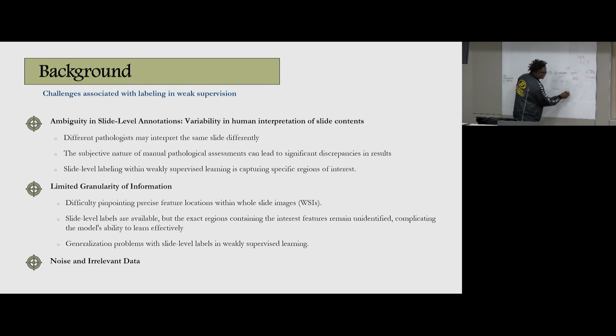Imagine another pathologist came and annotated here, and he found this is normal. What happens? The one will give this slide necrosis, and this other one we call normal, which is already ambiguous. How do you train it? It shows that the result will be biased somehow.